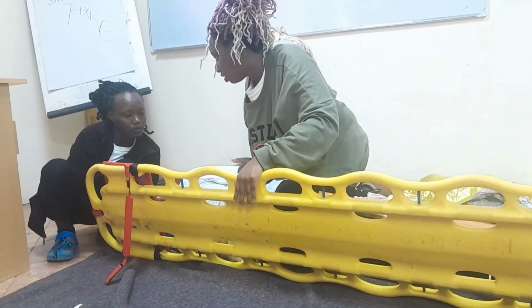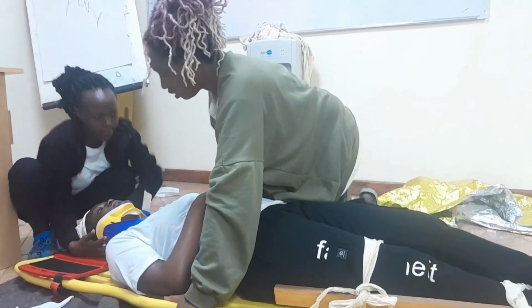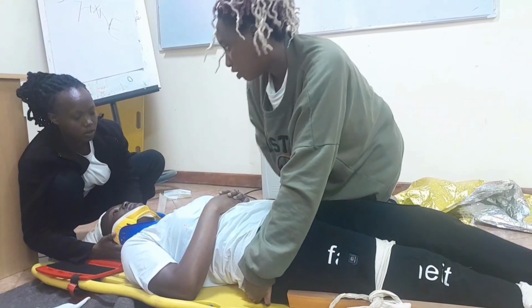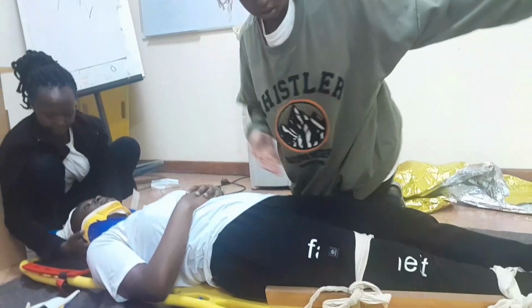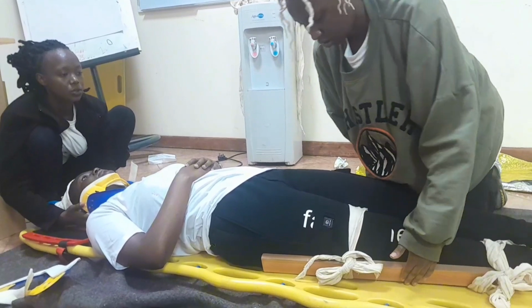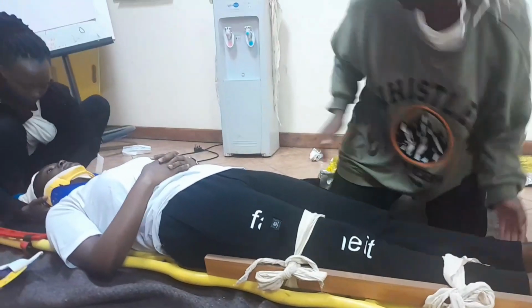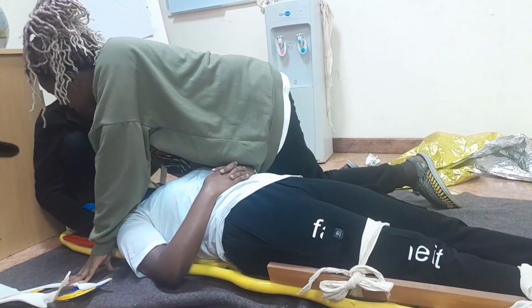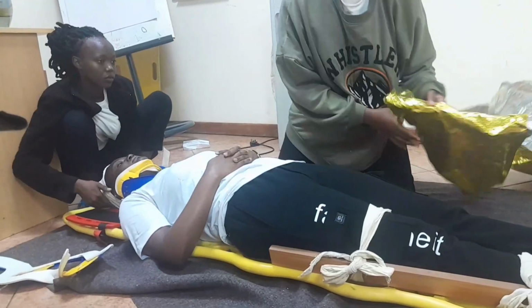Okay, on your count, 3, 2, 1. I'd like to straighten the patient on the spine board. On your count, 3, 2, 1. On your count, 3, 2, 1. Let me check if she's reached her end. She has. Let's cover my patient again.